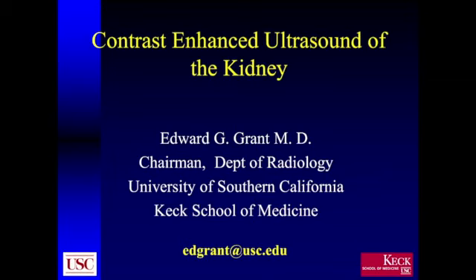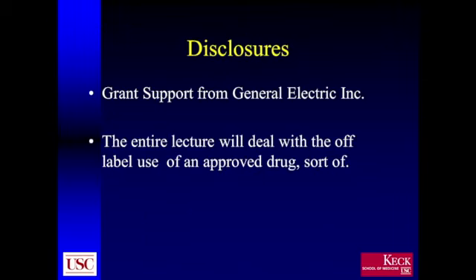Okay, this is Dr. Ed Grant. I'm the chairman of the Department of Radiology at the University of Southern California. And I'm going to be speaking for the next hour or so about contrast-enhanced ultrasound of the kidney.